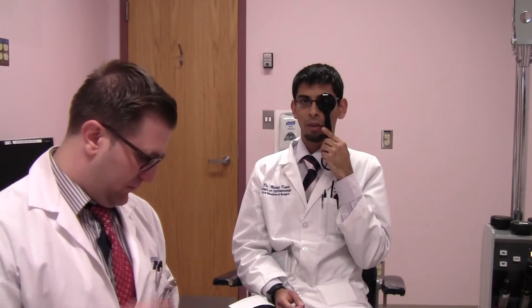Now I'm going to have the patient read the 20-20 line. Can you please cover your left eye with the occluder and read what you see on the screen? The patient says he can't read that. So my next step is to move up two levels to the 20-40 line. I'll push the buttons until I have the 20-40 line highlighted on my remote, then ask the patient again. Can you read the 20-40? He responds: R-H-K-S-D. Excellent — he correctly read the letters on the 20-40 line.